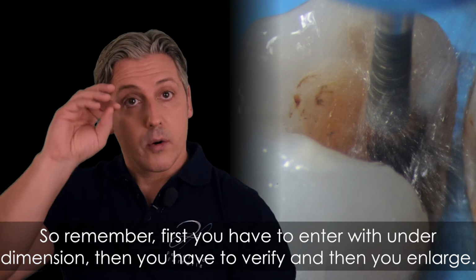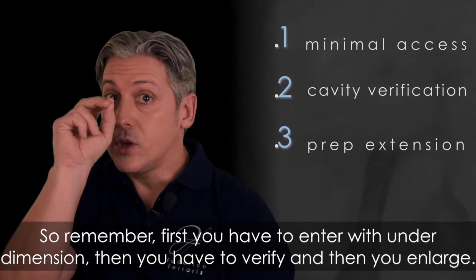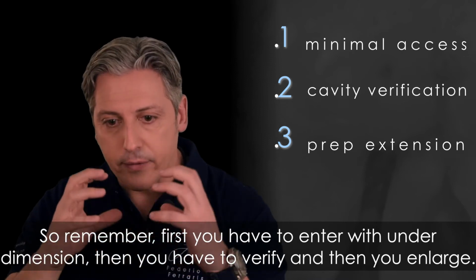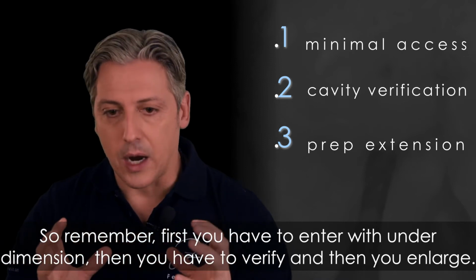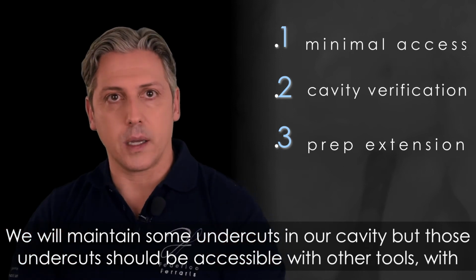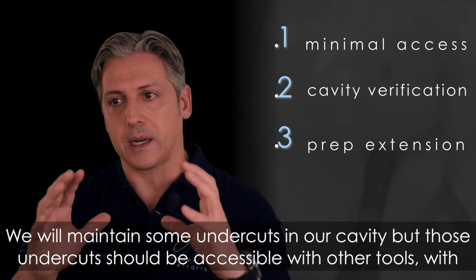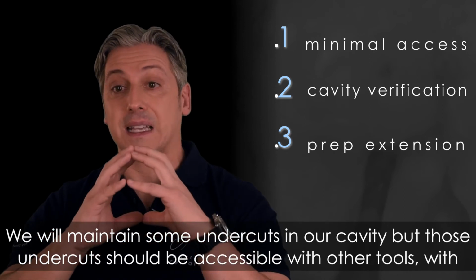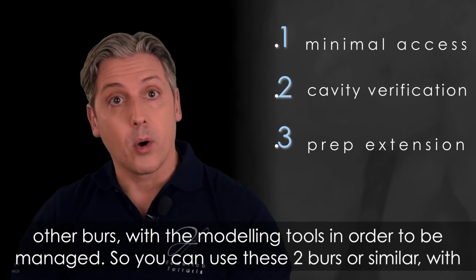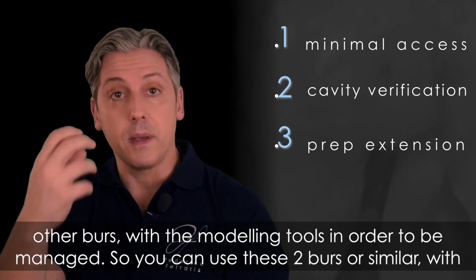Okay, so remember, first you have to enter with the under dimension, then you have to verify, and then you enlarge. We will maintain some undercuts in our cavity, but those undercuts should be accessible with other tools, with other burrs, with the modeling tools in order to be managed.